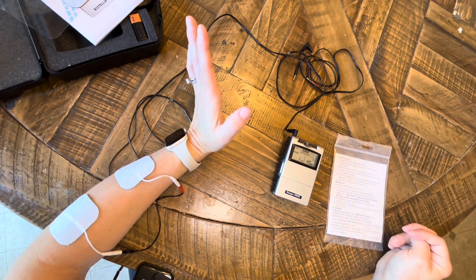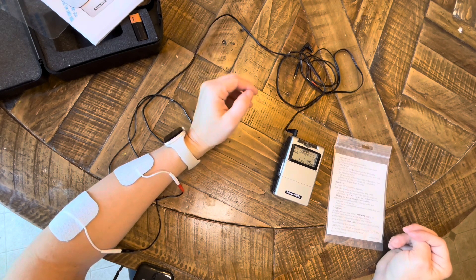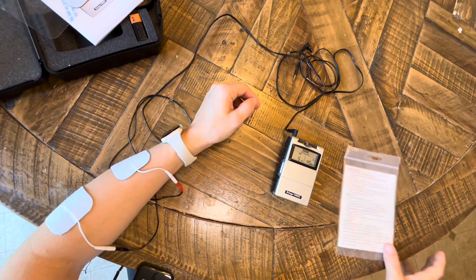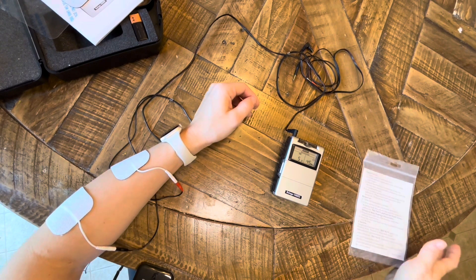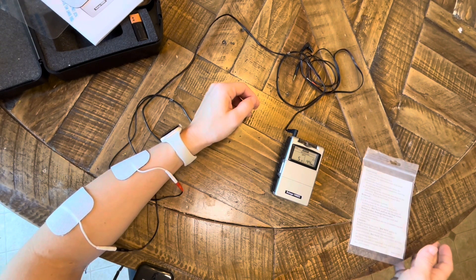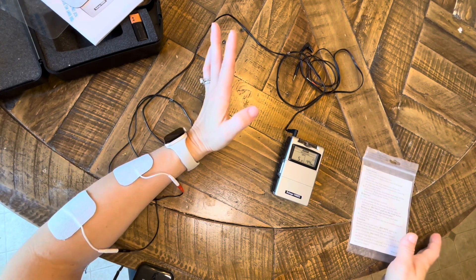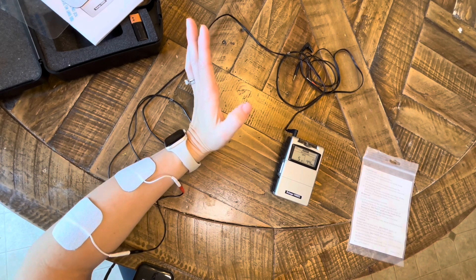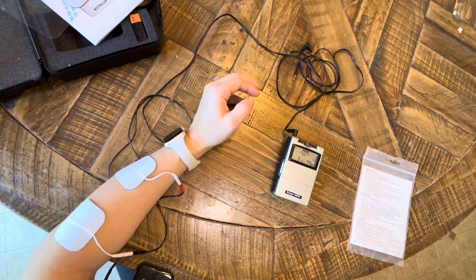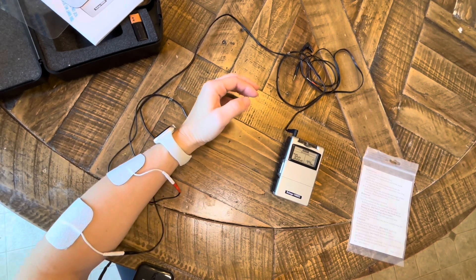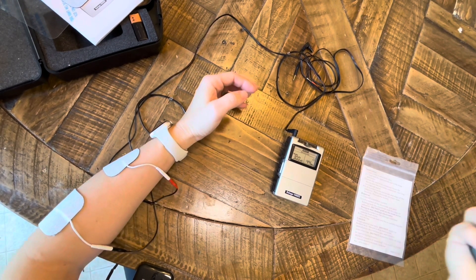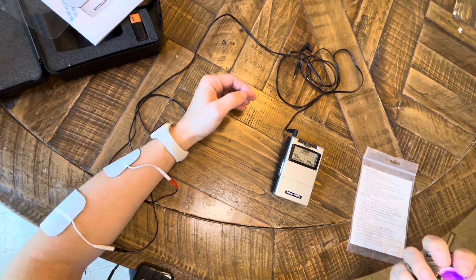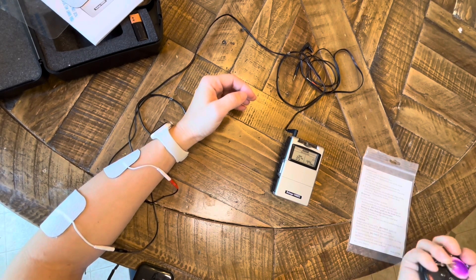Now keep in mind that I do not have a neurological condition or an orthopedic injury, so I get really good movement. A lot of the time, especially with our stroke patients who have some spasticity, you won't get full finger extension.